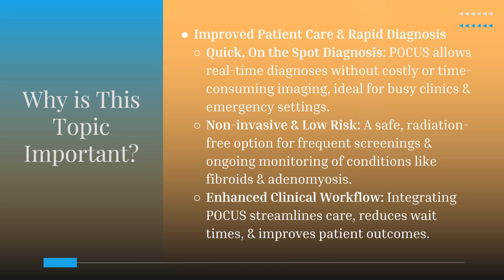So this topic is really important because, as we talk about in all the different sections, point-of-care ultrasounds are so valuable, especially for rural-based clinics and outpatient triage services, because you may not have access to a sonography department. For real-time decision-making, being able to grab an ultrasound machine and get a real-time diagnosis will reduce the cost, will shorten the clinical decision-making time, and allow the patient to be involved actively in the plan, because the clinician can say a lot more to the patient than the sonographer can until the radiologist interprets the results.